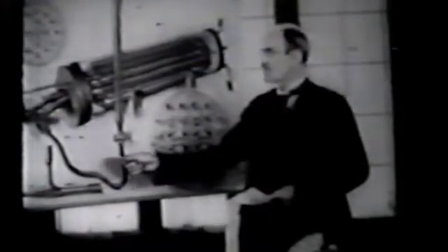We have here a system of celloidin tubes attached to short glass ends at either end of this apparatus. Through these tubes, substances can be made to diffuse out of the bloodstream of a living animal. At this point, the apparatus is attached to the artery. The blood flows into the apparatus, up one tube and down another, and so through the whole system, and enters the body again at this point.